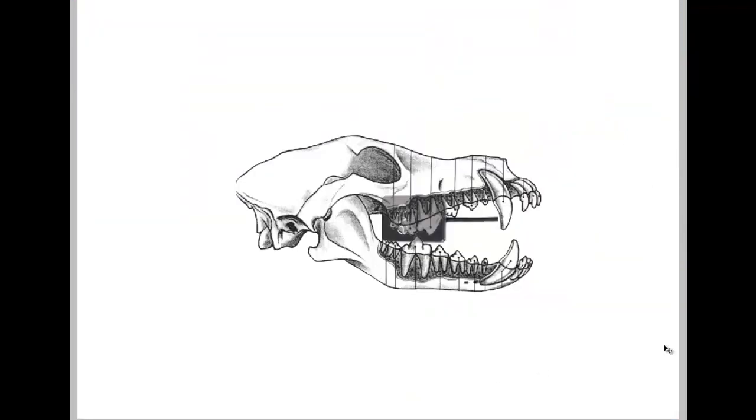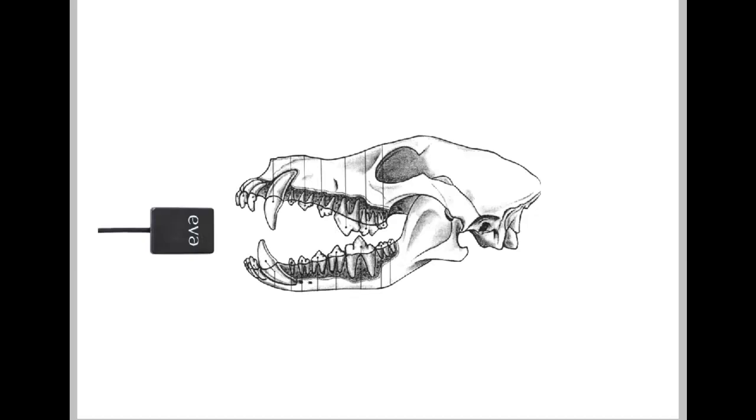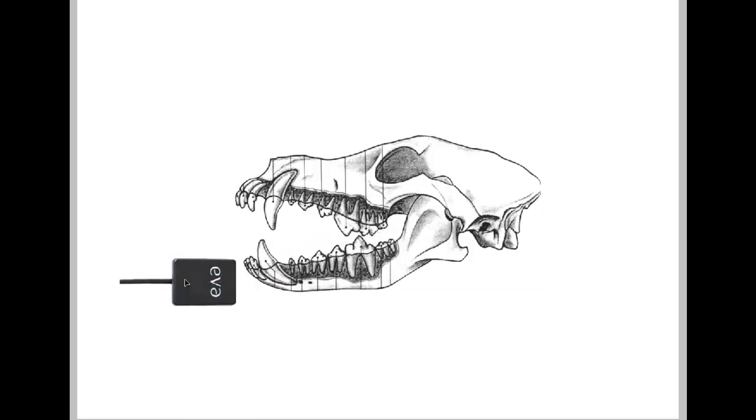So again, if I want to illustrate taking shots on the left side, for instance, if I'm going for quadrants 2 and 3, say molars or premolars, my sensor would be in this position. It would be in the landscape position, and we would place it for the upper teeth either here or here, and for these lower teeth we may place it here or here.